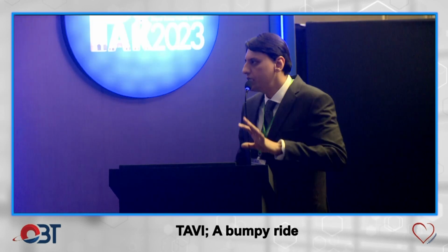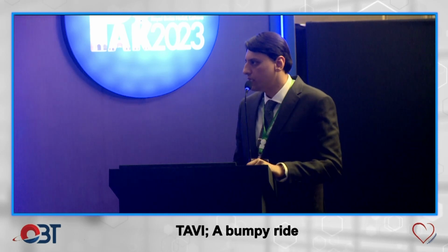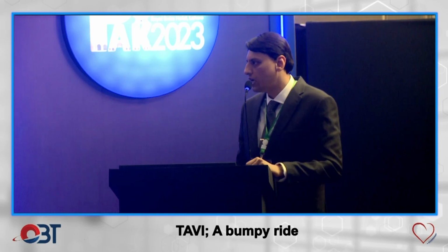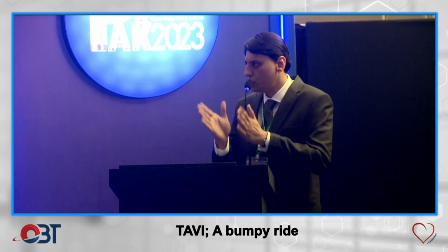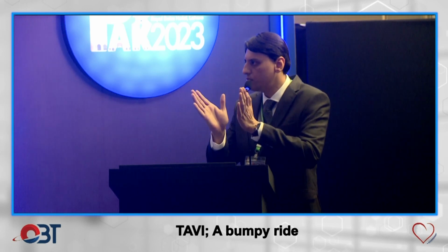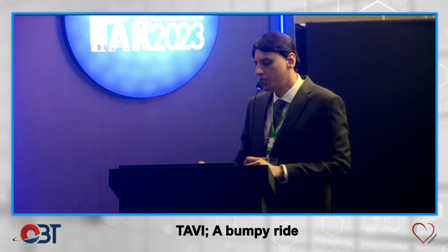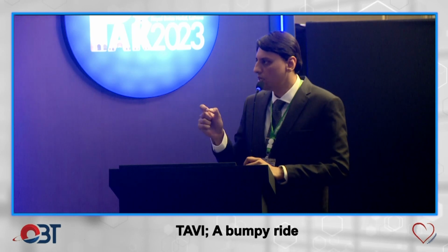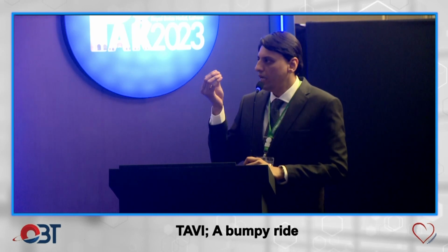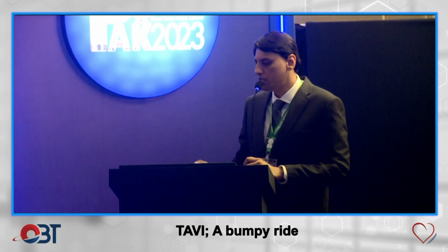Basically, for valve sizing, we use annulus measurement, average annulus measurement, perimeter-derived valve sizing. It also depends upon the anatomy, whether it is tubular, tapered, or funneled. There was a recent article that showed that if you size your valve based on the virtual annulus plane, then you have an 88% success of appropriate valve sizing.